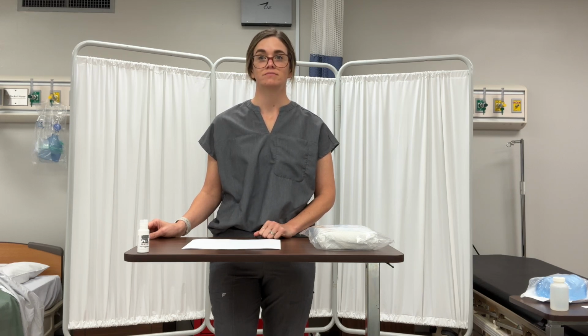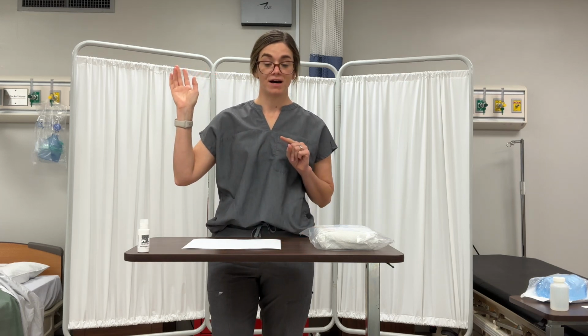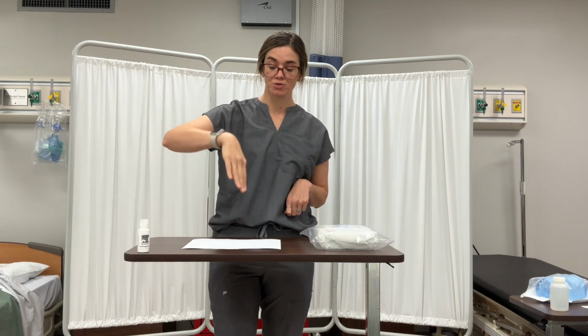Sterile people or items contact only sterile areas. Unsterile people or items contact only unsterile areas. Is my hand sterile right now? No, I don't have a sterile glove on. So if my sterile field is right here, doing this means an unsterile item just touched a sterile item, which means the sterile item is no longer sterile.